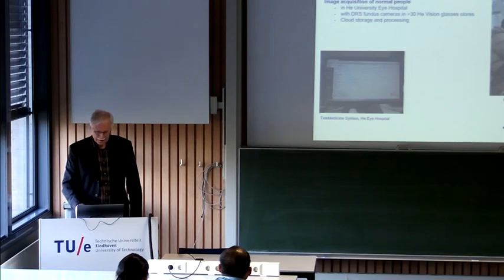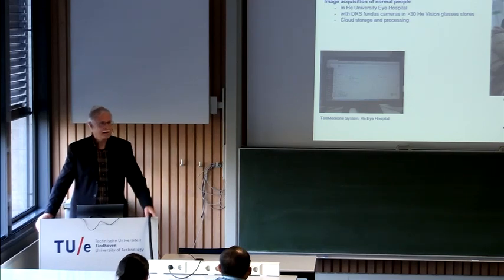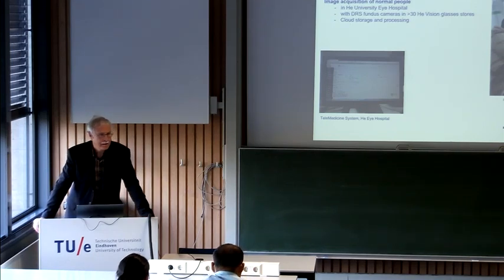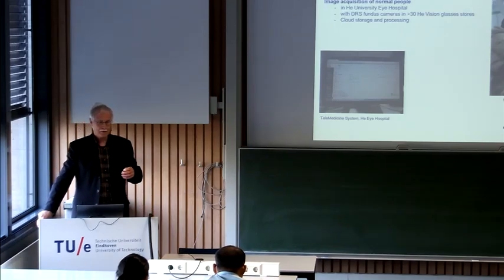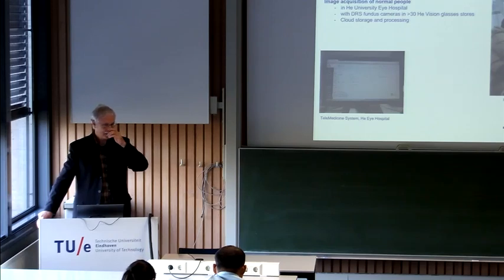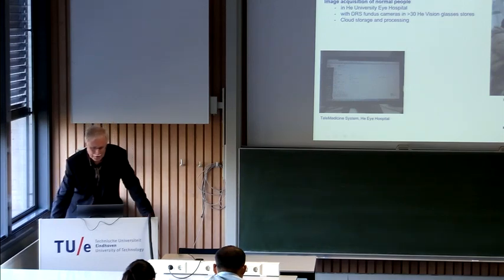And we did data acquisition in these vision stores. You see me here in one of these stores. We had DRS cameras, that's an Italian company. They're fully automatic. You sit down as a patient or as a person, the camera automatically finds the pupil, automatically does autofocus, automatically takes the picture, so the operator only has to press the start button, and then the whole thing is taken. And this goes the whole day. So we had thousands of these images.